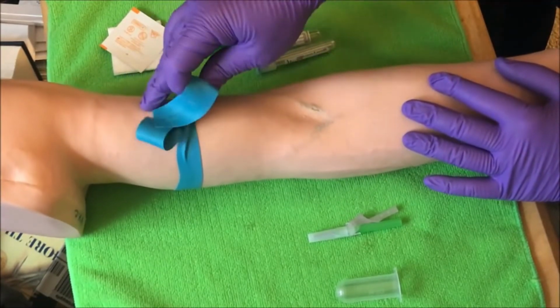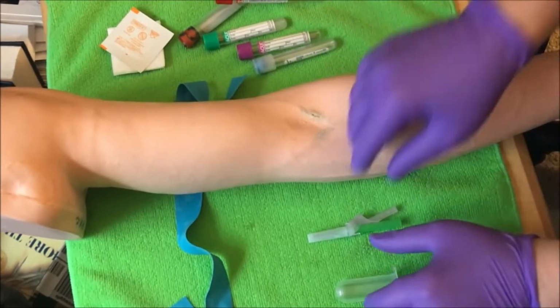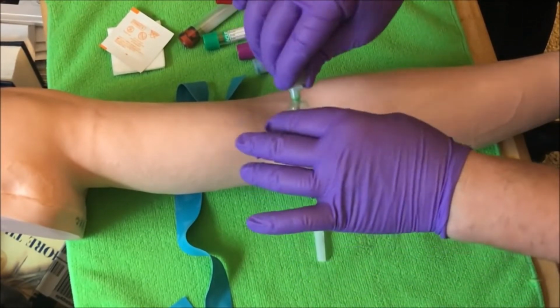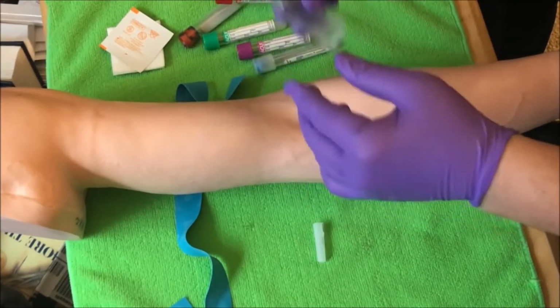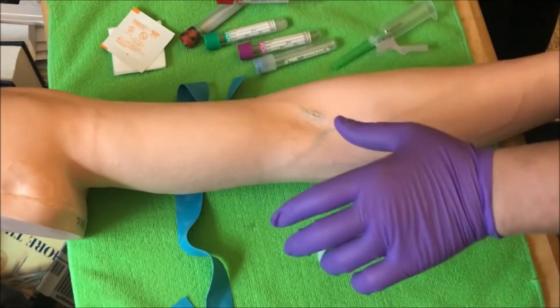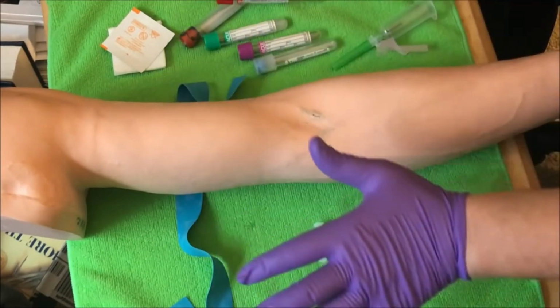I release my tourniquet, pulling towards myself. And then I go into assembling my equipment like I just showed you. So I take my needle, 21 gauge, pull it here, attach my needle, bring this down, make sure it's secure, and I place it down. Now you're going to notice that all my equipment is on my right side because I'm right-handed. If I'm left-handed, I want all my equipment over on my left side.